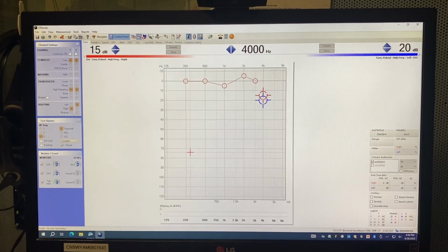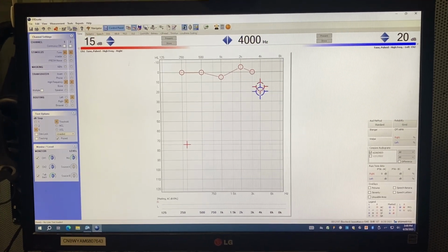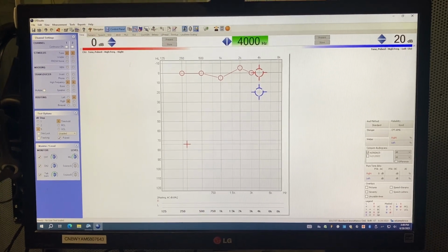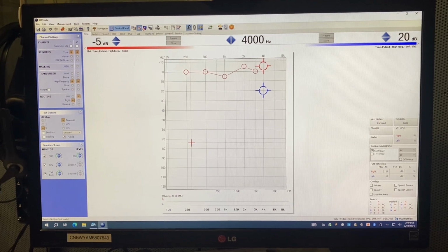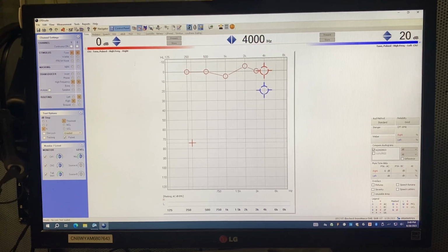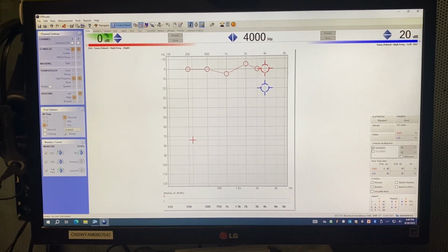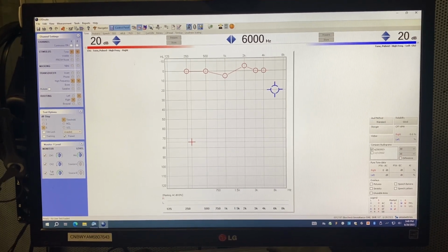Now we go over to 4,000. We're going to familiarize. Wonderful. Lowering that tone 10 decibels. We got that response twice. We'll recheck. Perfect. We're going to go over to 6,000.